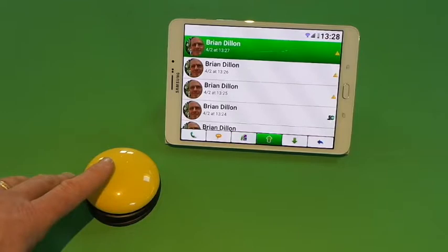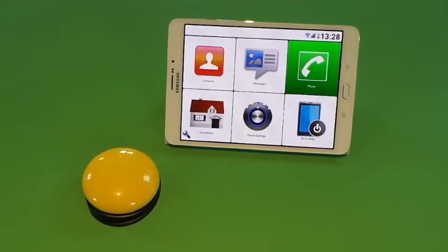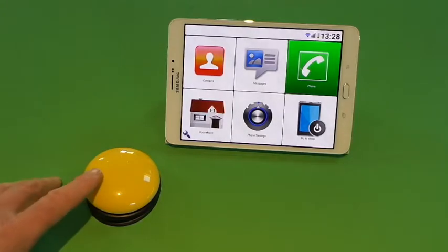So we can see that the primary functions that a switch user requires from their telephone are integrated into a single consistent user interface. Making phone calls, being notified of a missed call, and sending text messages.